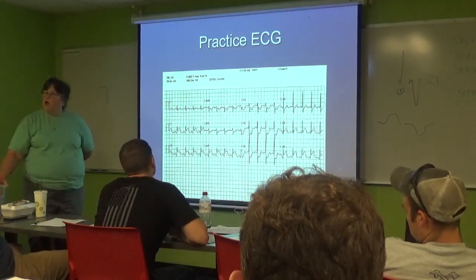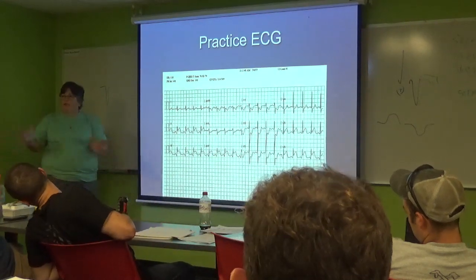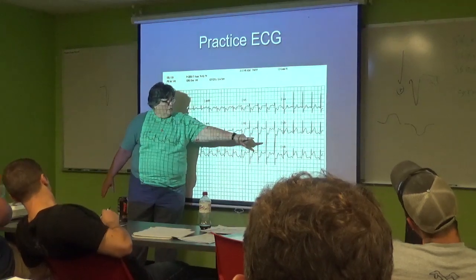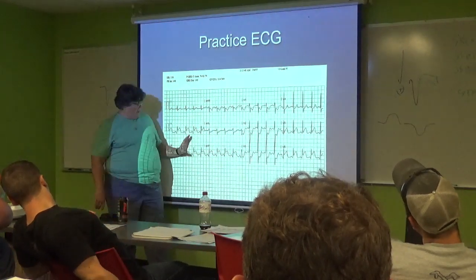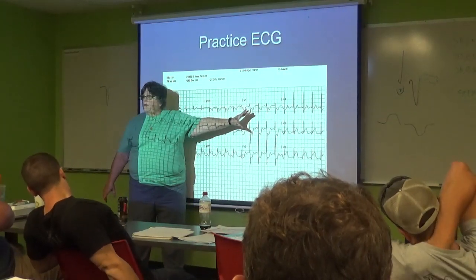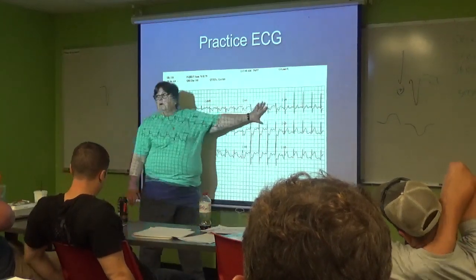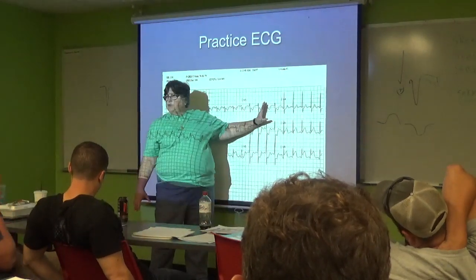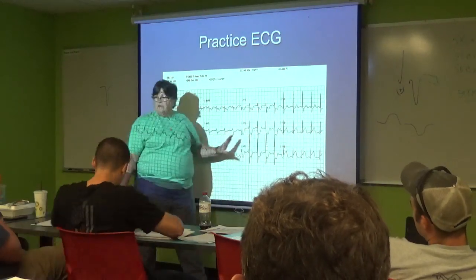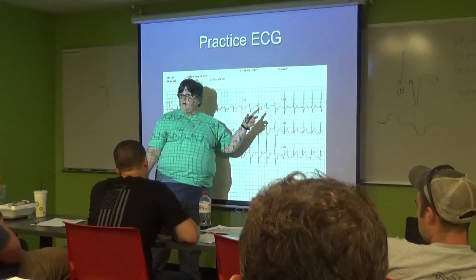All right, so what do we want to call this? There's three things going on, just put it together. Inferior, posterior, anterior. You could do inferior, posterior, you'd be correct. Okay. With lateral, and correct. Not septal, this is posterior. So you have inferior, posterior MI with lateral involvement. How else could you say this? Infralateral with posterior involvement. They would both be correct.